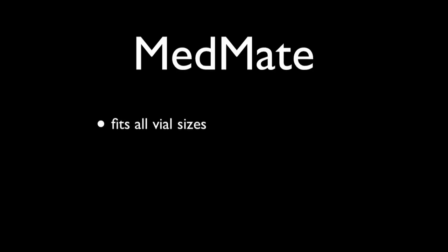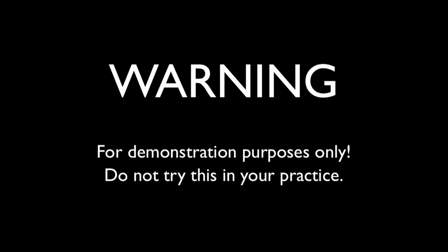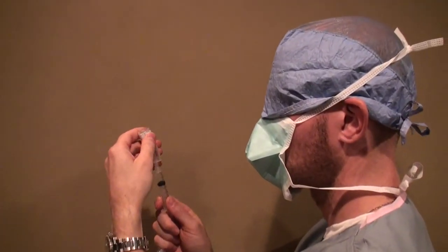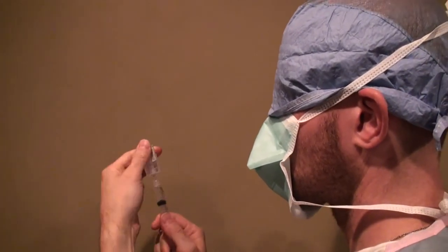MedMate fits all vial sizes, guides and centers the vial onto the needle, and eliminates the needle stick risk. The following is a demonstration and not intended for clinical use. The provider shown is blindfolded, and yet effortlessly draws a medication and transfers a specimen into a specimen tube.